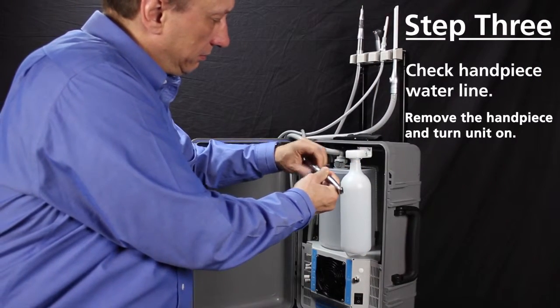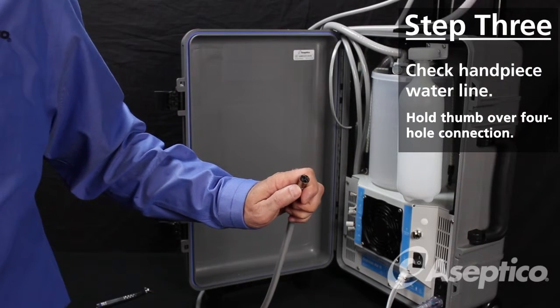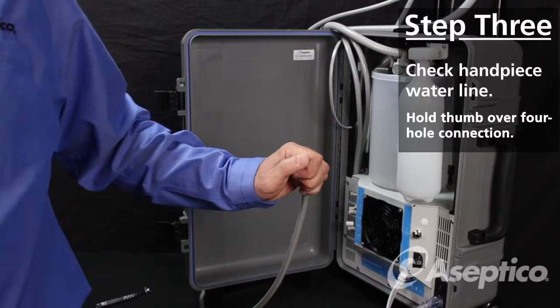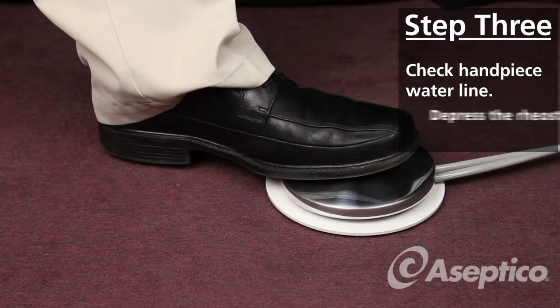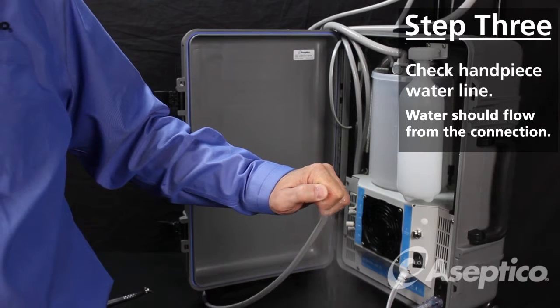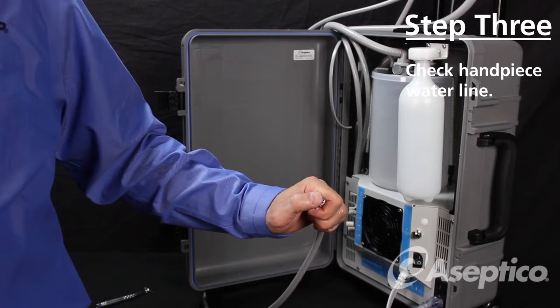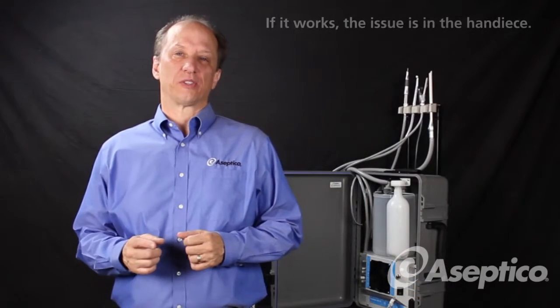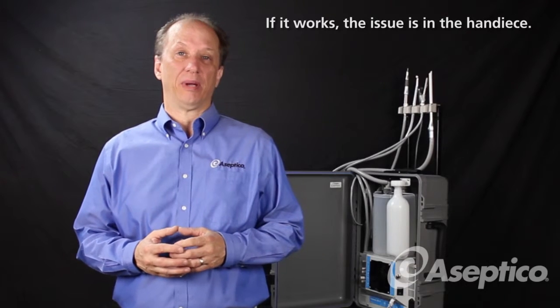Remove the handpiece and run the unit with the handpiece disconnected. Hold your thumb over the four-hole high-speed handpiece connection to block the holes. Now depress the rheostat, and after a few seconds you should feel water start to flow. There's a valve in the Express unit that needs back pressure to get the water to flow. If this test works, then there's probably a clog in your high-speed handpiece, and it needs to be sent in for repair.